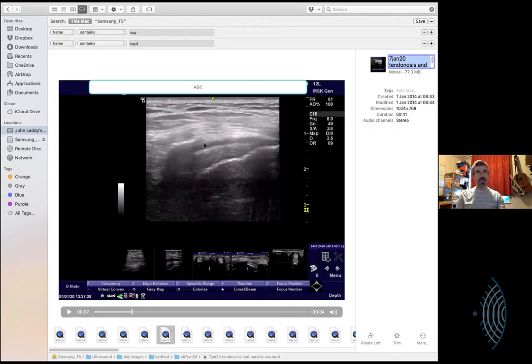All right, where are we? Supraspinatus. Everyone talks about this stuff as being fluid. How can it be fluid? It's always puzzled me because, again, that and cartilage show up dark as well, and I like the idea, almost like an endometrium, that is all polypy, and it's just absorbing sound like cork.